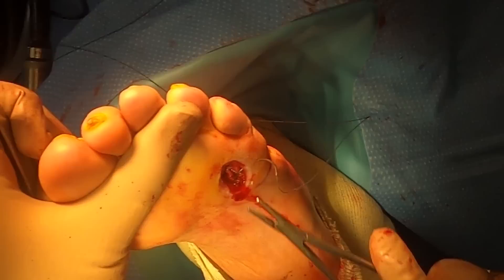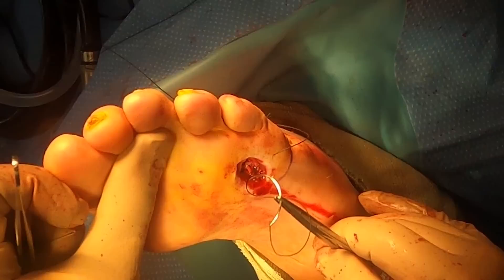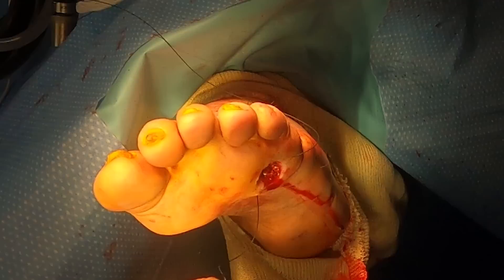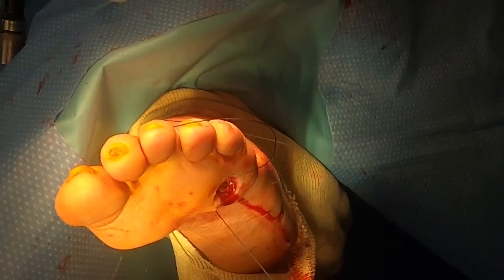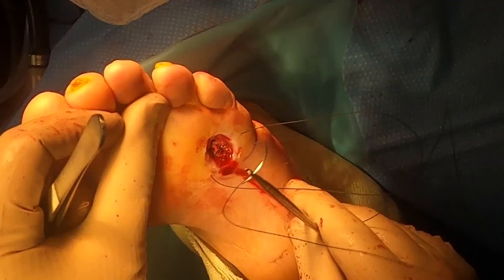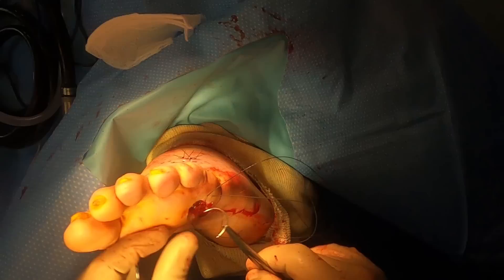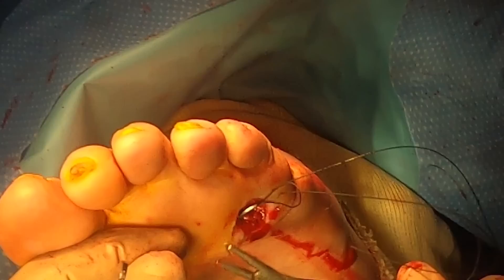What I need to do first is go ahead and bring these edges together. This is a pretty strong suture along with a pretty hefty needle. All I'm trying to do here is bring together this skin and soft tissue, which is pretty tough on the bottom. We're going to tie it a little bit tighter so that it can at least slowly contract and be a little bit easier to eventually heal.